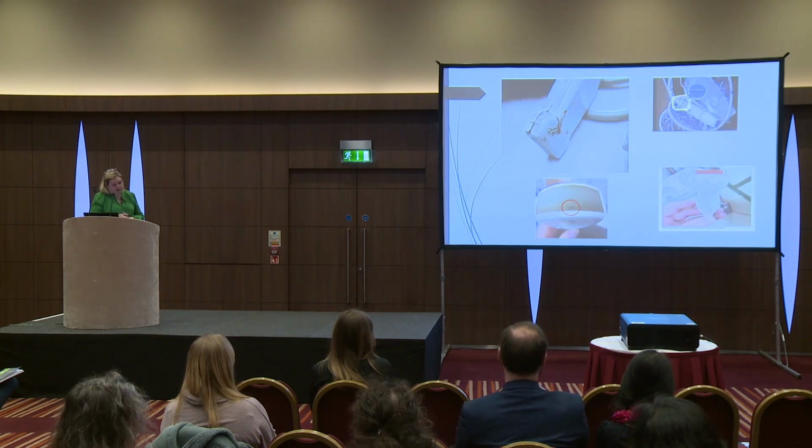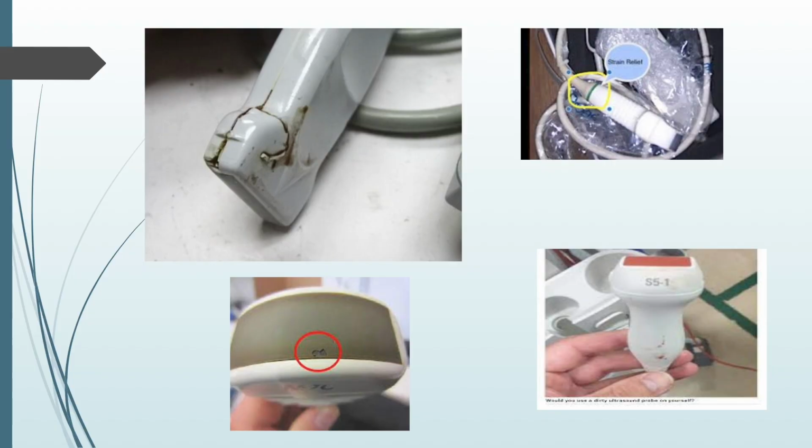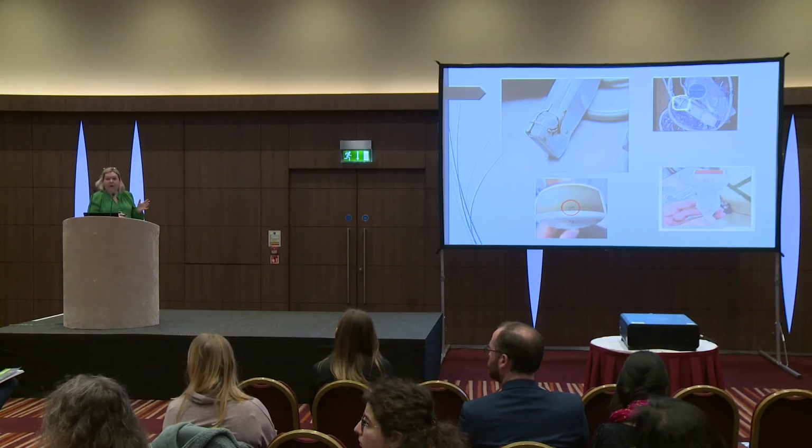We can see from this slide the damage and risk involved through lack of education. Improved education for all staff is essential. When users are educated, the risk to our patients acquiring a healthcare-associated infection is reduced. Would any one of us like to have a probe like this used on us, but do we actually take any notice of the probe when we're having an ultrasound scan? I know I probably wouldn't have previously, but I do now.